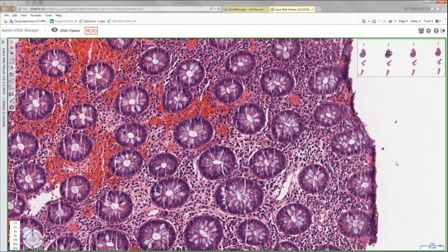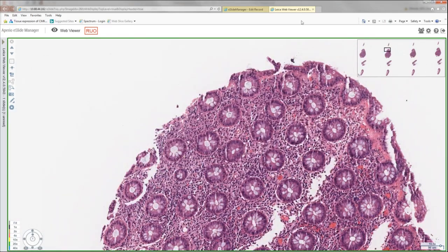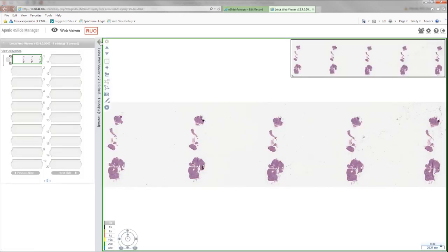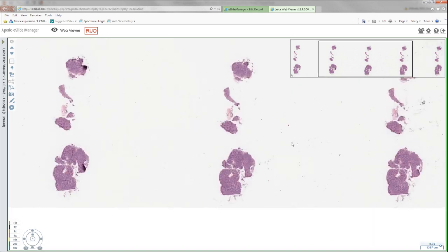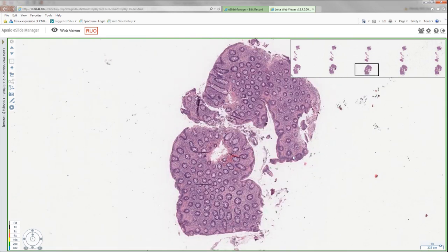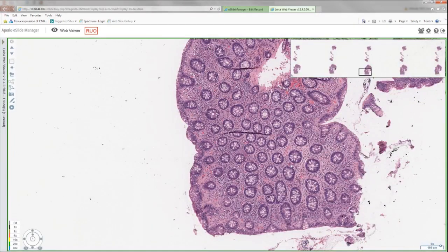This patient actually, by the time that we got this biopsy, had this diarrhea for a long time, has been tested for a lot of things, and everything came back negative. So the diagnostic suspicion at the time was lymphocytic colitis. This is from a 65-year-old female, also with chronic watery diarrhea, maybe more of a striking case. Again, normal architecture. When we go to the close up a little bit, we can still pick up the blue lamina propria.